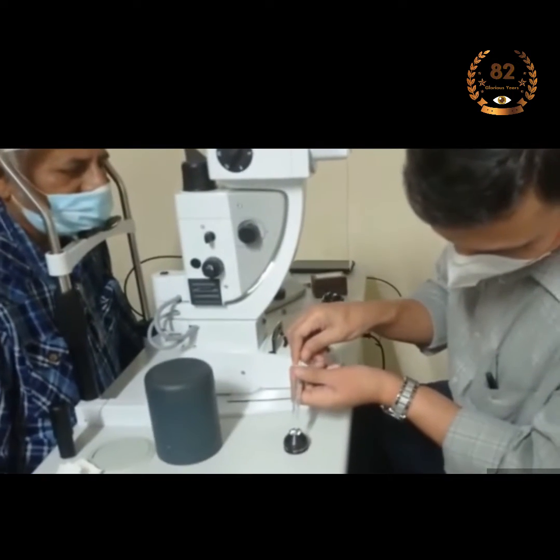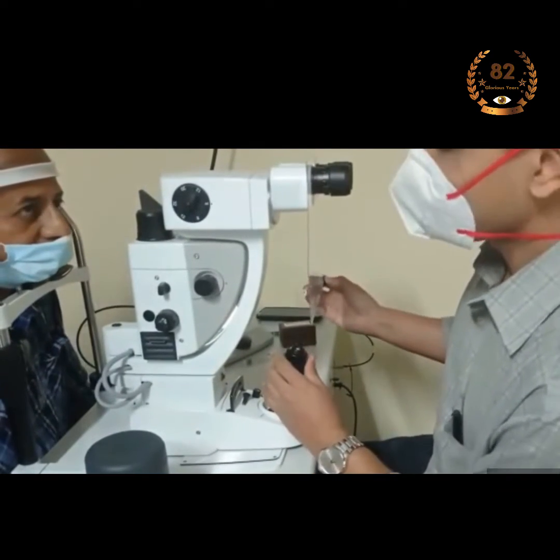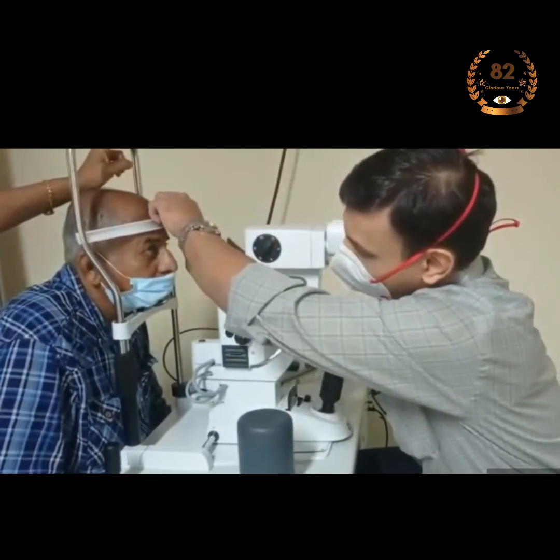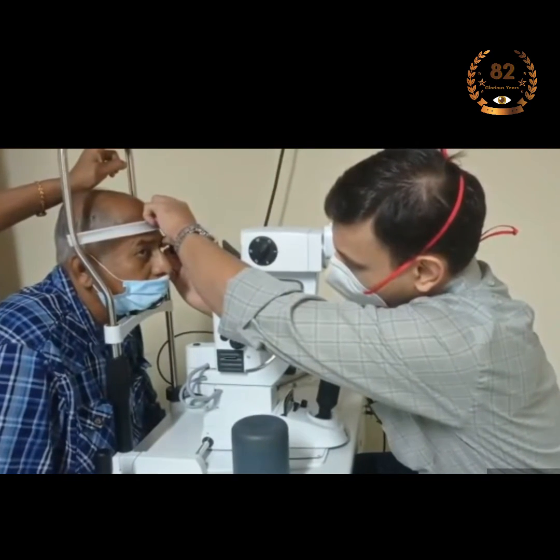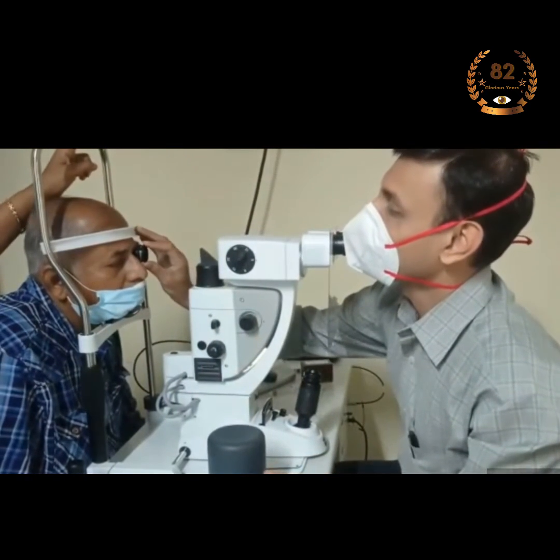So how will it be for the patient? It's a simple and short procedure. Here's what happens: the eye that needs to be lasered is anesthetized with topical anesthetic eye drops. Then the patient has to rest their head in front of the laser setup as seen here. After this, we put a visco gel at the base of the contact lens and then place it on the eye to focus the laser beam at the proper location. Then we adjust the laser beam parameters and deliver the burns to the retina.